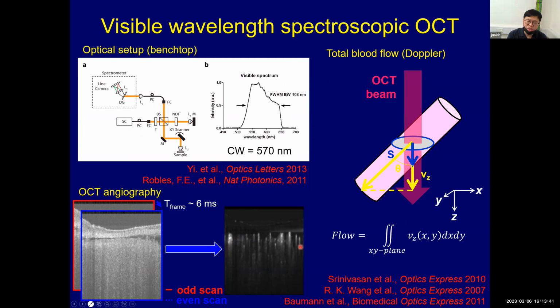This is because when the light hits the blood and the vessels, they are highly scattering, and they keep changing. So if you take out the static component, you are left with the vessels component. This is how you can get the vasculature information, or in other words, you can get an angiogram without applying a contrast agent into the vessels.